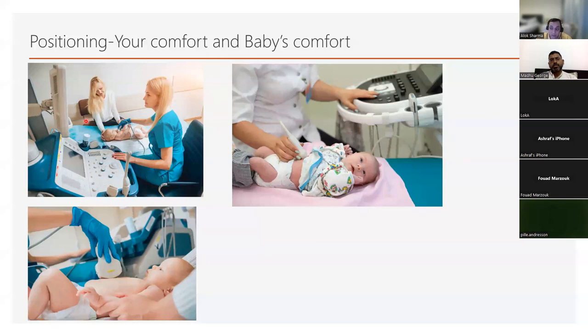Here, you have to be wary about the risk of hypothermia. Here, you have to be wary about the fact that you don't have adequate exposure. What about this image? Yeah. So this is an ideal image. Can you see how the baby's restrained? He's interested. He could be distracted with the pacifier and some sucrose, but this is ideal exposure for you.